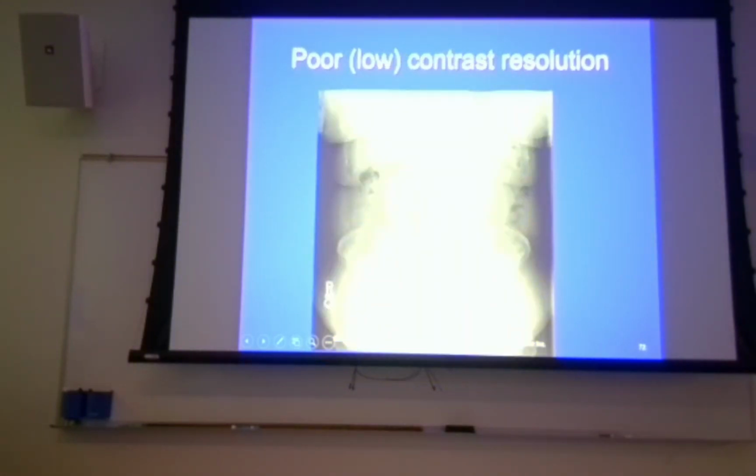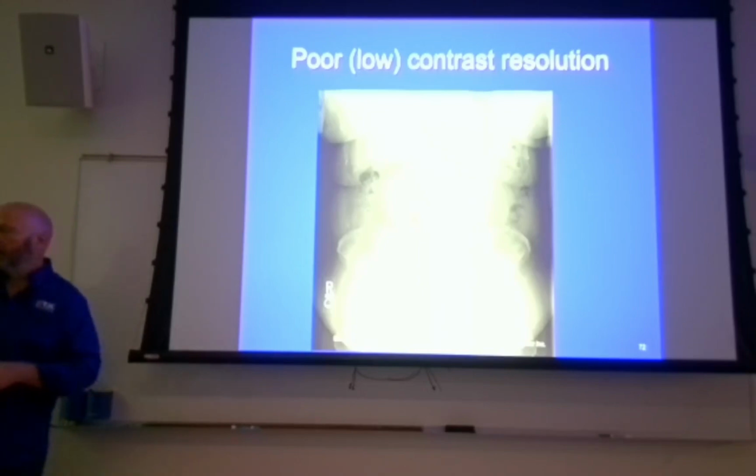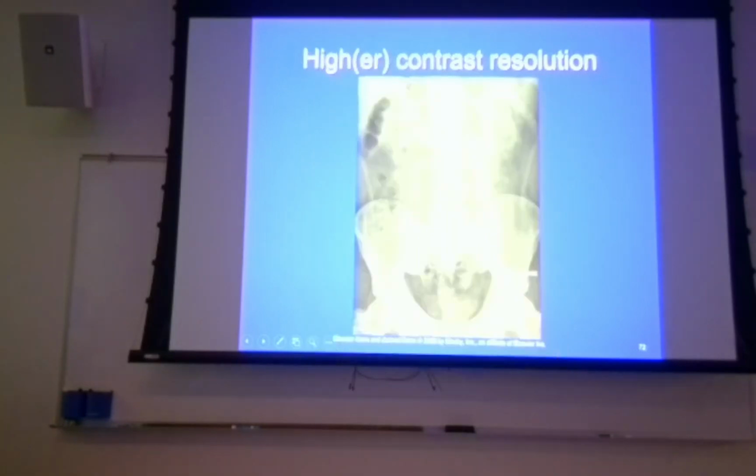So this patient is obviously quite large. You see multiple rolls here. So this patient, even on a digital image, is going to demonstrate low contrast. I think this is actually a screen film image, but I can't make any kidneys out on this, but that might be one right there. Can't make this one out. We've got fecal matter as well. So it's still applicable, and in hypersthenic patients, you're still going to see a loss of contrast.